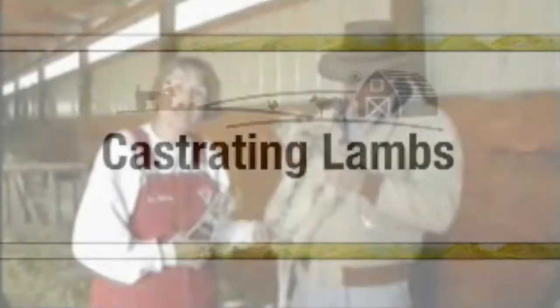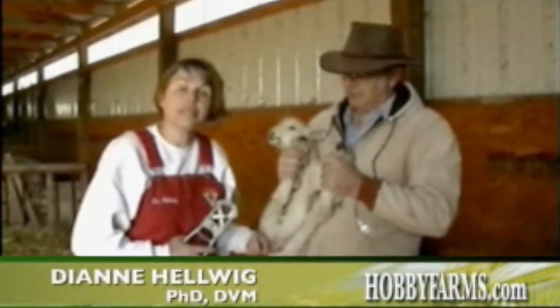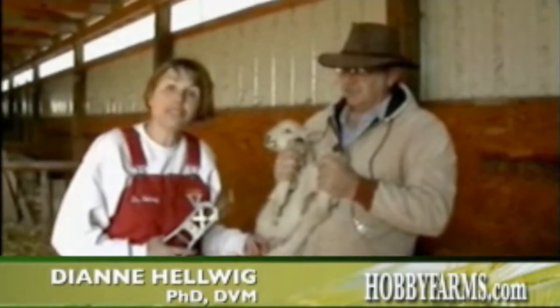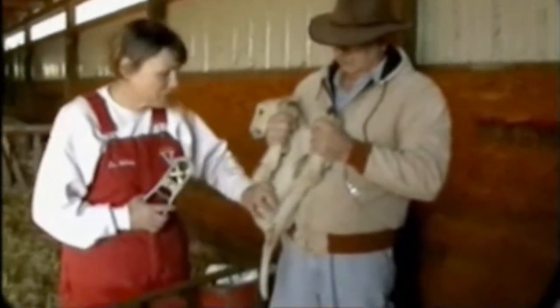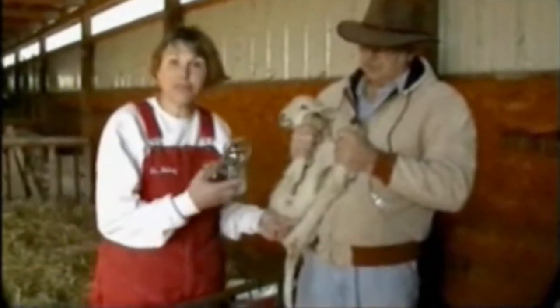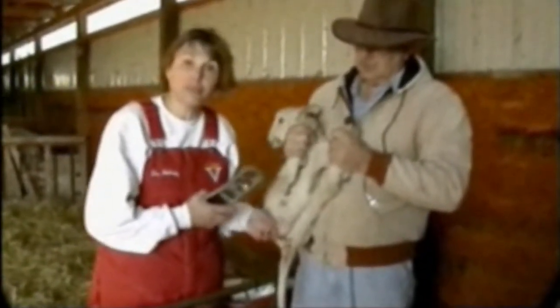The next thing we're going to do is castrate this lamb using an elastrator band. There are several ways to do this. Some people like to take the testicles out directly, in which case they would cut the bottom of the scrotum with a knife and pull the testicles out. That is best done at a very young age. All of this is best done at a very young age. My husband and I prefer to use the banding method, having used the other methods before.